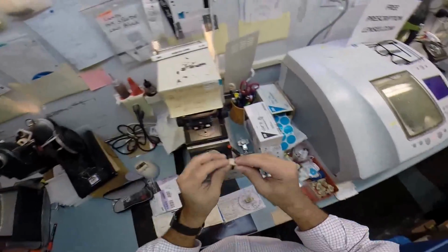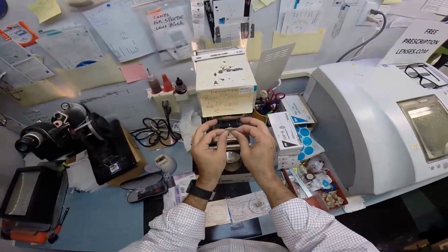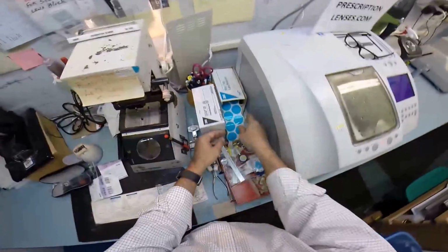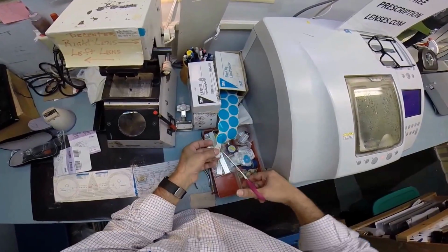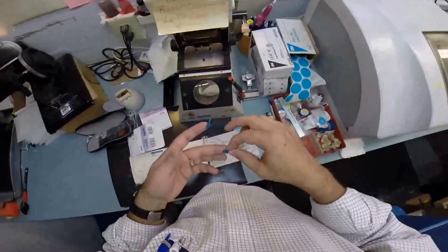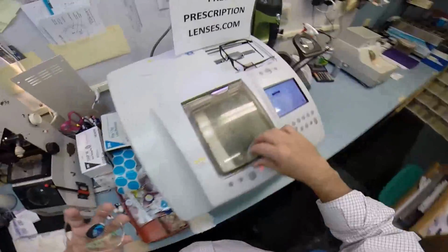Sorry, honey. Okay, so put the blocker in there, pull the sticker off, put that on there, pull the tape away, and now let's get those 3 dots lined up where they're supposed to, and the vertical one right through the center. Now, because you're anti-glare coating, it makes it a little bit more slippery while it's cutting. And so I'm going to put one more sticker on there so it grips really well inside the chuck. I'm going to stick one on the left lens and now the right lens, and let's go ahead and begin.